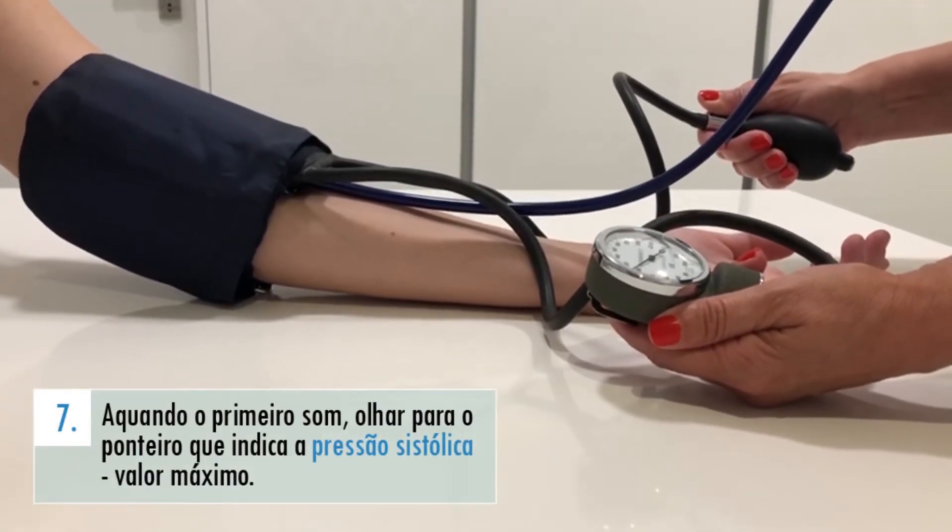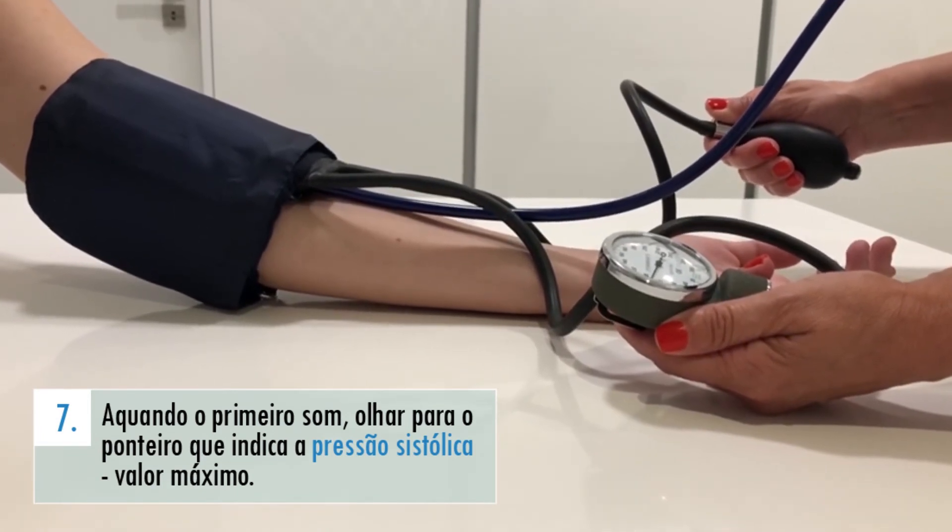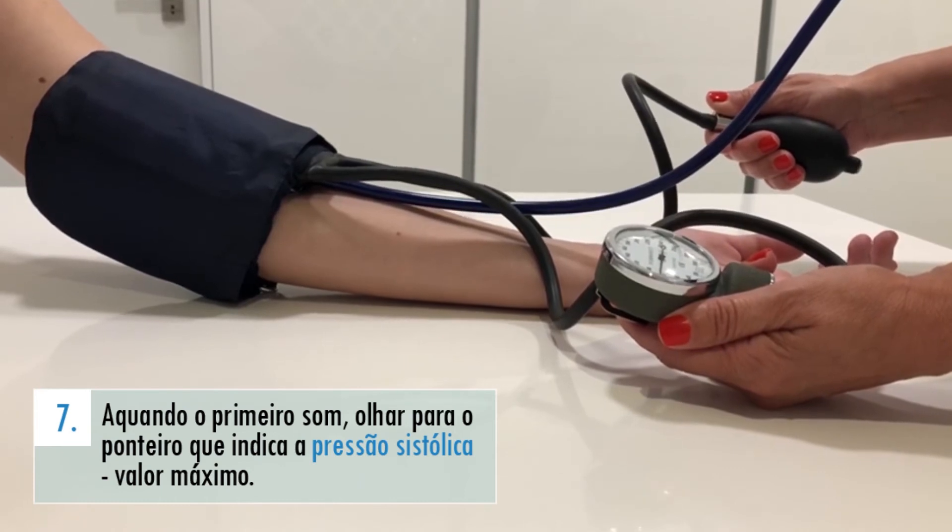Aquando do primeiro som, deve anotar o valor que o barómetro indica. Esse corresponderá ao valor máximo de pressão arterial, ou seja, à pressão sistólica.